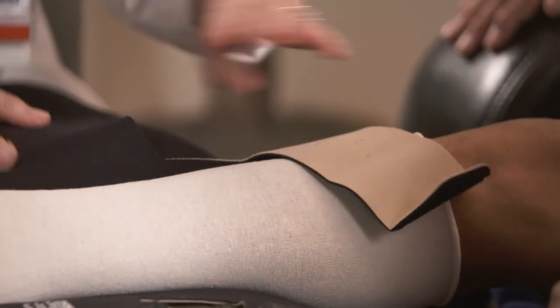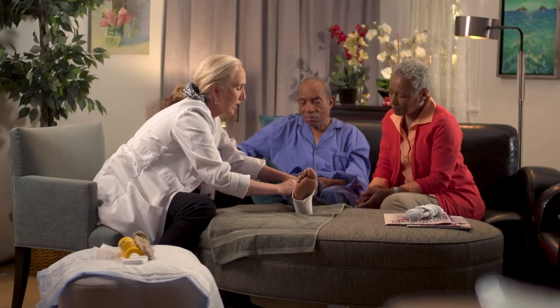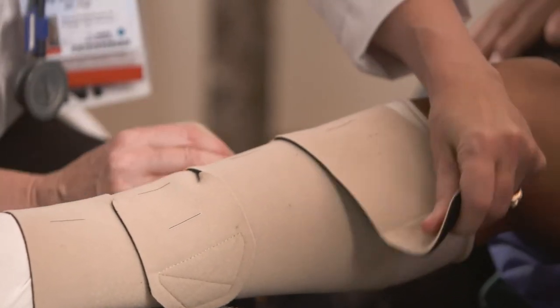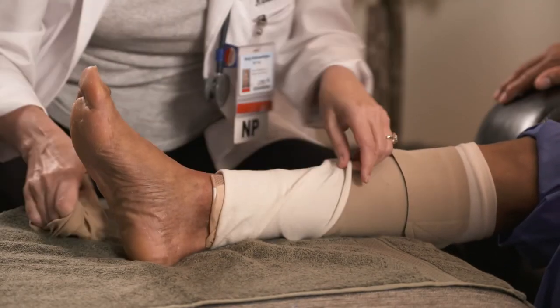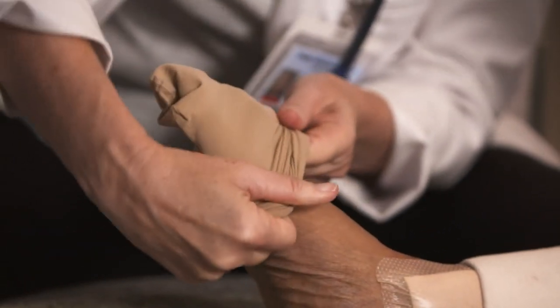You want it to be firm enough, tight enough, that it gives him a little bit of compression. I'm going to make sure there's not a gap in between. And this side, the very same thing. Attach the Velcro. Once that's done, you can roll these down for comfort again, and roll this one. Then put the sock on. It's a lot of compression, so you're going to feel it kind of tight on your feet. And then you just pull that up over this part.